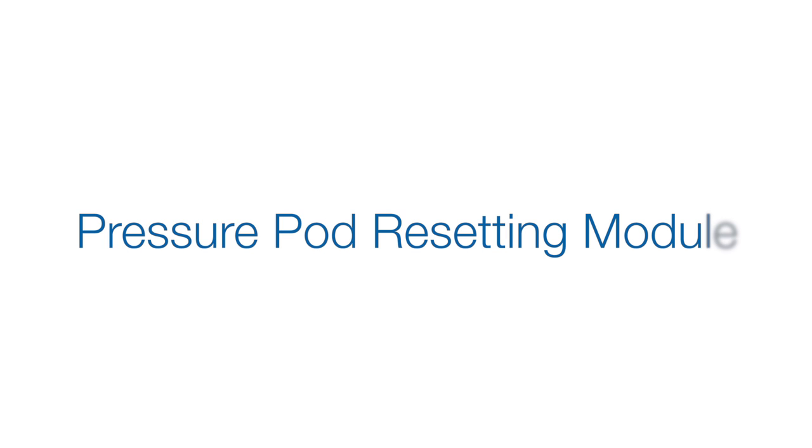You have selected the Resetting Pressure Pods module. In this section, we will review how to reset both access and filter pressure pods on the Nextage System 1.